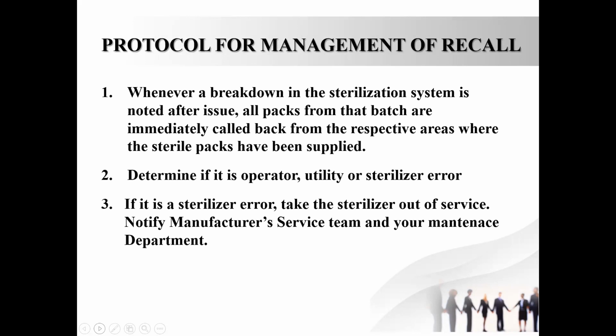So what is the protocol for management of a recall? When you notice a breakdown in the sterilization system, that means you notice a sterilization failure, all packs from that batch are called back from the areas where they have been supplied.